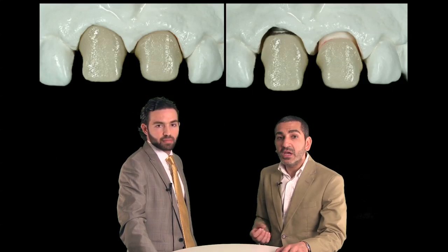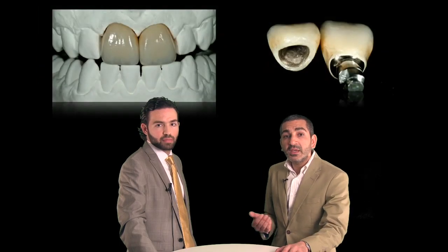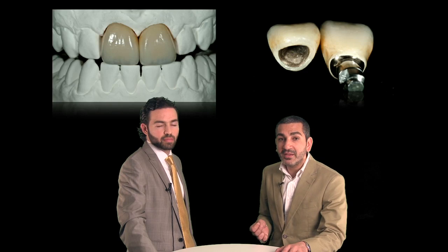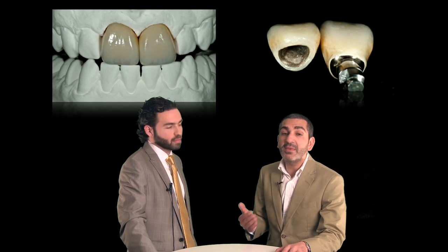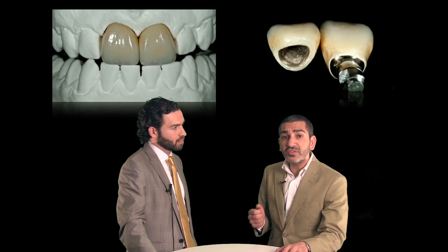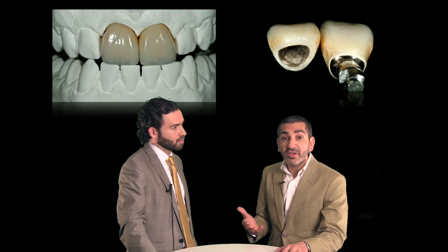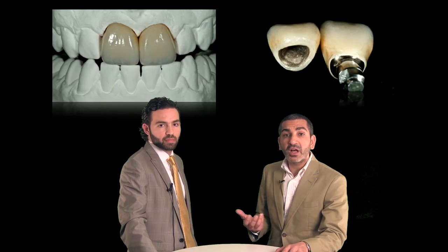In addition, the other thing the technician can do is that on the natural tooth, he can cut back the facial aspect to a certain degree, up to 2 millimeters. This is called the Geller modification. And this 2 millimeter cutback allows light transmission and better aesthetics in the gingival area if the patient has a high smile line. And the warmth will come from the gold colored coping.